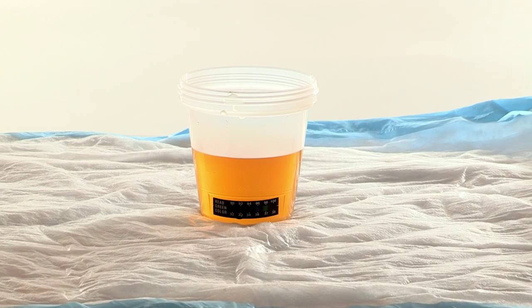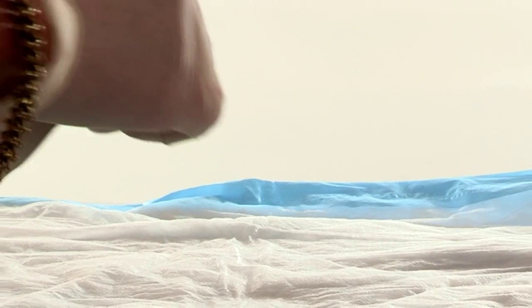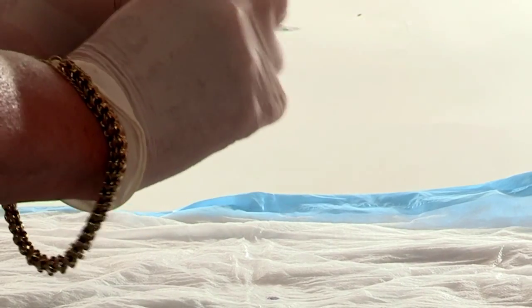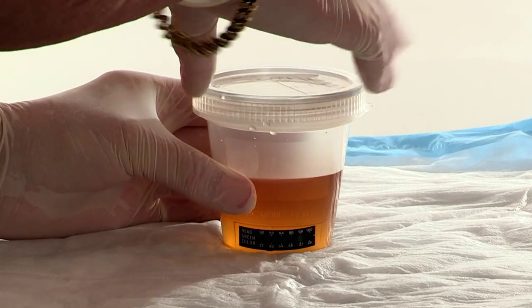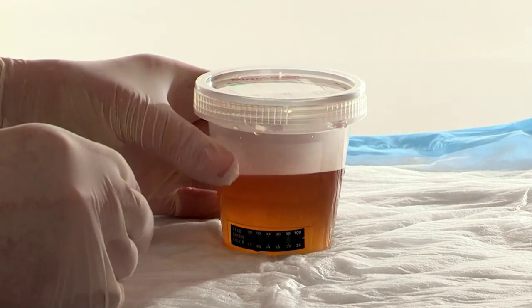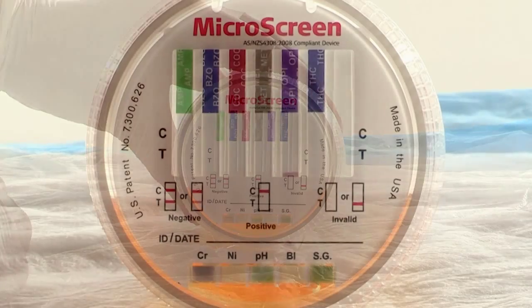Now, I have checked the temperature of this urine in the temperature strip, and the indication is that it is within the range of body temperature. So I am now going to take out of the sealed pouch the screening device, which is a lid. I will now screw the screening device onto the collecting vessel and turn the entire device onto its side.